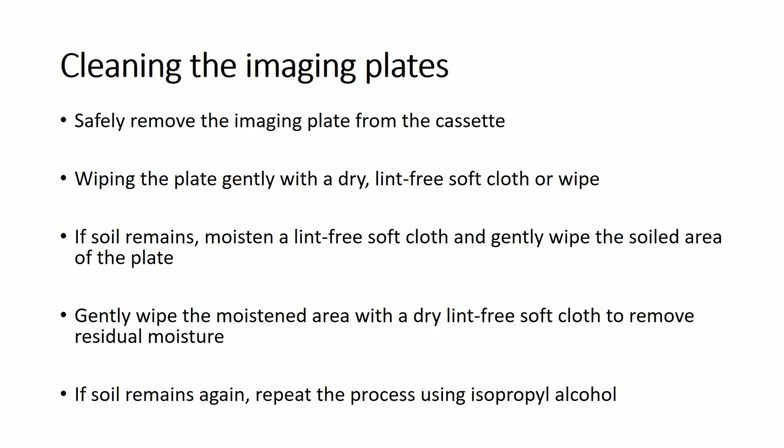If soil remains on the plate, then you can use a very mildly moistened lint-free soft cloth and gently wipe the soiled area of the plate.